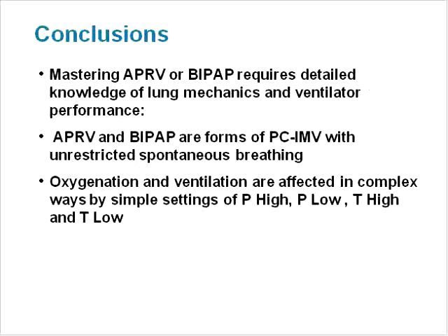In conclusion, I would like to leave you with 3 basic take-home messages. First, I hope this presentation has impressed upon you that mastering bi-level modes of ventilation is a more complicated task than it first appears. To do this, you must have a detailed knowledge of both lung mechanics and ventilator operation. Second, bi-level modes, such as APRV and BiPAP, are technically just pressure control IMV, but with unrestricted spontaneous breathing.